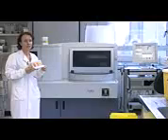This is the Tigris GenProbe analyzer, which carries out the molecular detection of the nucleic acids of chlamydia and gonorrhea using a process called transcription-mediated amplification.